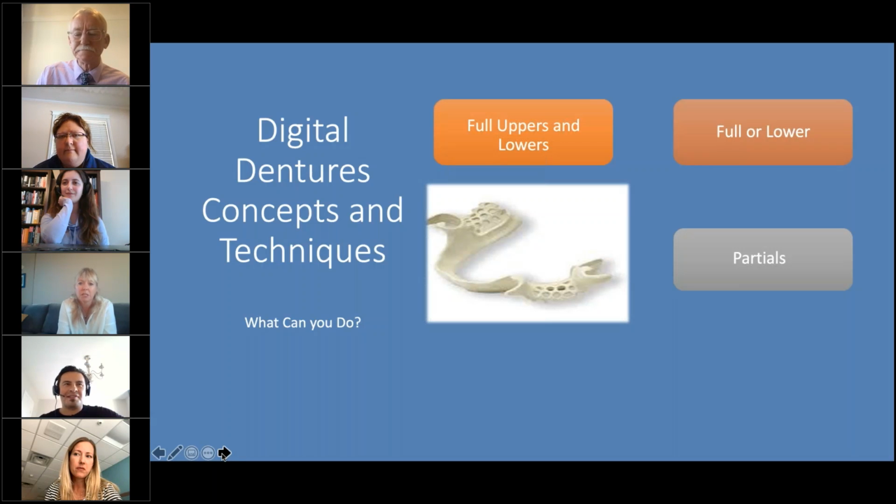I can only speak to that in terms of some clients who have shared that knowledge about the PEEK. I understand that some people have, but I'm very curious to know how Esther and everybody else have tried it out. It's on my to-do list of things to attempt. And just like Tanya, I'm seeing it at conventions and some chatter in some of the Facebook groups, but myself, no, I have not experimented with it. We've experimented a little bit with acetal resin, especially for temporaries, and it's very millable, very fast, and we've had good success with that. But we have not tried PEEK or Solvay or anything to that effect as of yet.